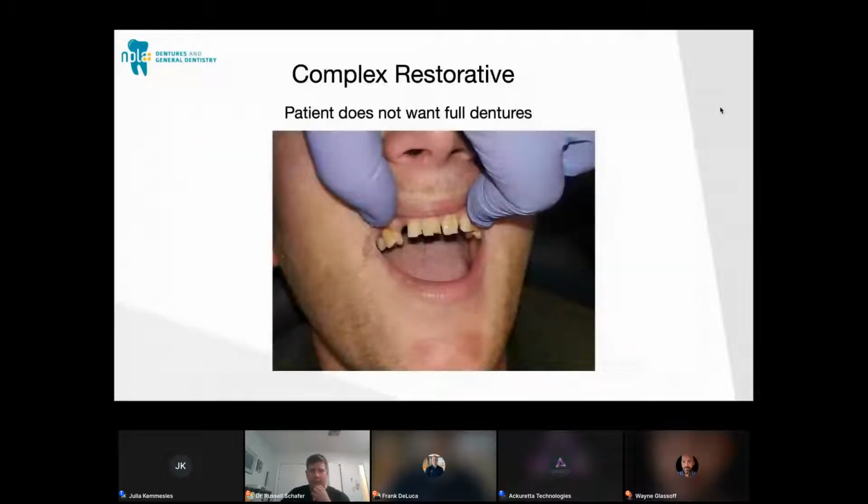You know, we can see the teeth right there. This guy's gone through some hell, and he's broken everything. And you can already imagine, you can see just how he's incising on those upper four anteriors right there. Next slide.